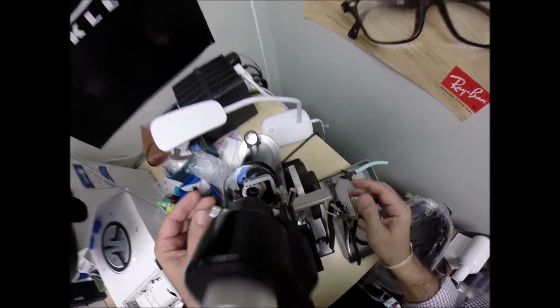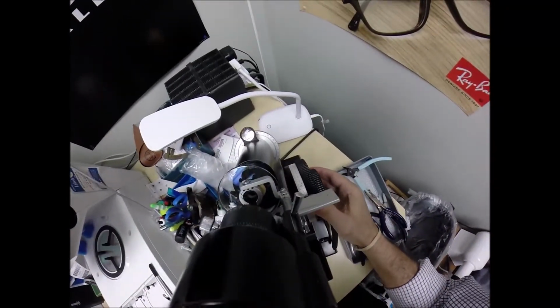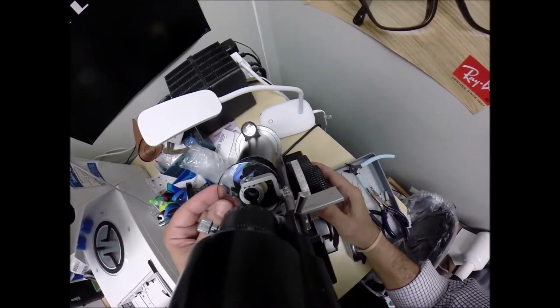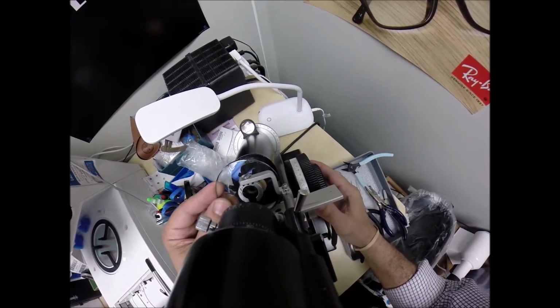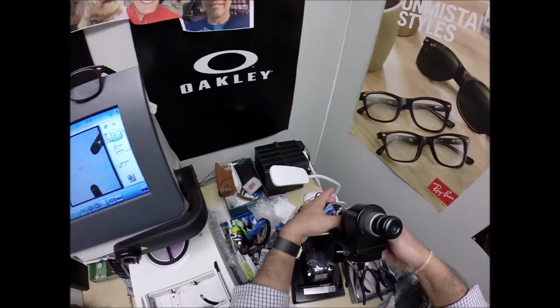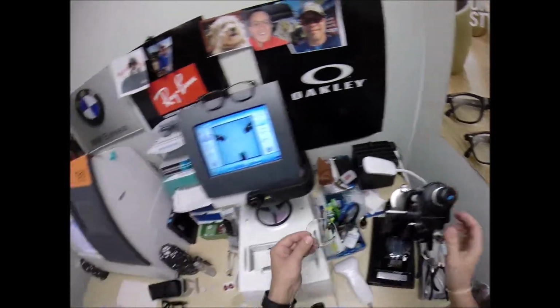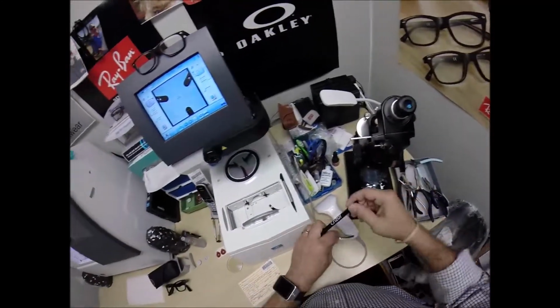So, I am getting 2.75. Let me check your astigmatism correction. I'm getting 4.75, so that is correct. That is the right lens. I just want to make sure everything is centered perfectly. I'm going to put 3 dots on your lenses. Can you see those 3 dots? If not, I can darken them.